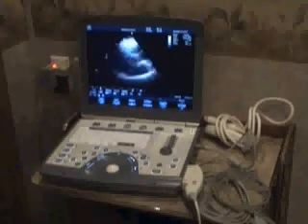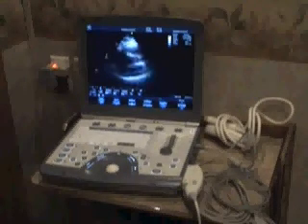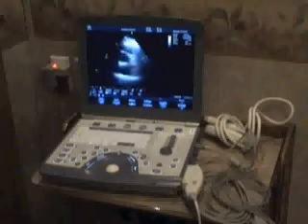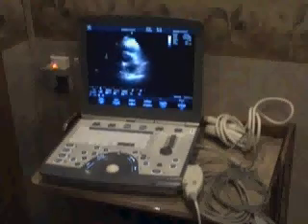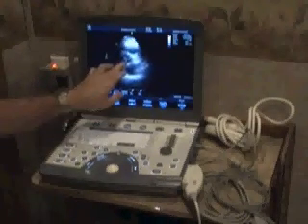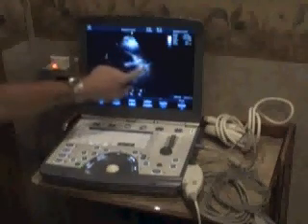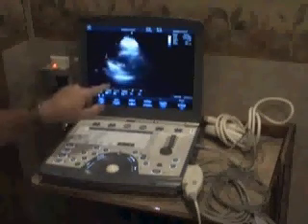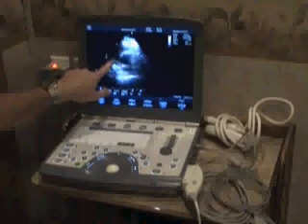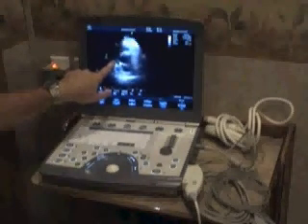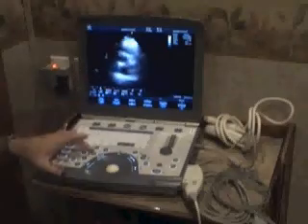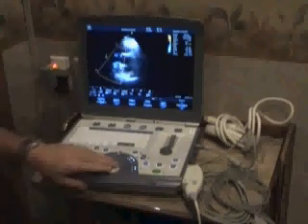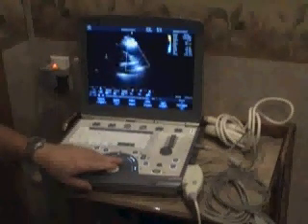Once we've achieved those measurements, we rotate into a parasternal short axis, which is going to show you several things including the aortic valve. This would be your aortic valve here in the center. It's going to show me my pulmonic valve and my right outflow tract and pulmonary artery. It's also going to show me my right tricuspid valve in this view. From the aortic valve, we're going to put color and take a picture of the aortic valve in color.